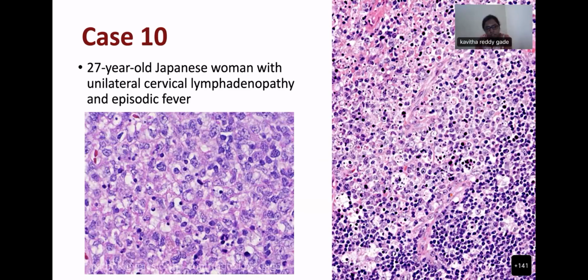Necrotizing granulomatous. Yeah, it could be a necrotizing granulomatous lymphadenopathy. And the etiologic agents, are you thinking something infectious? Give me one infection that can look exactly like this. EBV, leprosy, histoplasma. Excellent. EBV as well, right? It can actually have this. Generally, we don't really know the etiology of Kikuchi, and many people have gone after infectious causes. But the other infectious organisms that you have just mentioned, you can detect them, either by staining, serology, or culture. So any of those things are available for correlation.